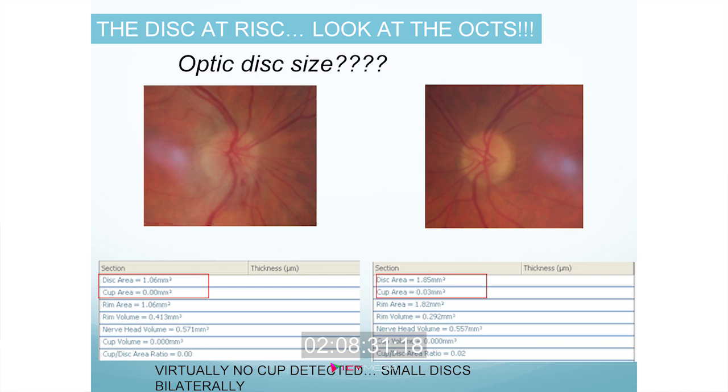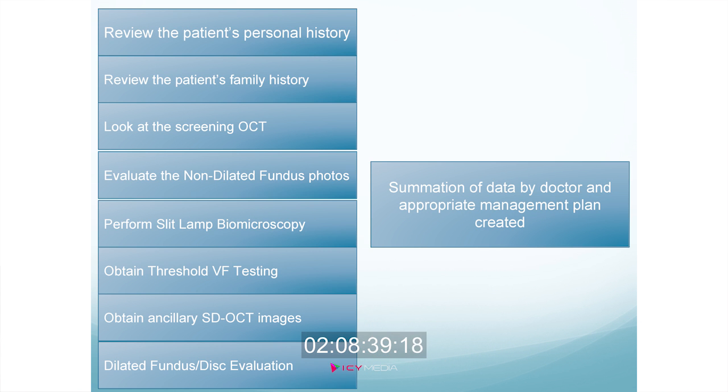So it's almost like he was at the plateau, and then he had one risk factor that pushed him over the hill. And that's the situation in this case. So the summation, again, what we went through with him is we had the history of the nocturnal hypotension. He was complaining to us about decreased vision or some kind of problem, inferior, in his eye, okay? We went ahead and we got a screening exam, which didn't give us very much information because it's acute, okay? He wasn't affected yet. The GCC hadn't been affected yet. We got the disc photos and confirmed that essentially there was a problem in that right eye, which is the eye that he was complaining about.